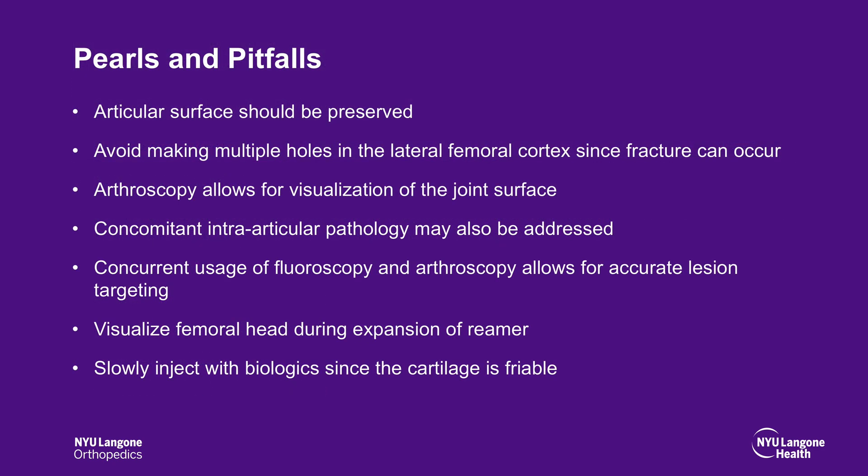There are a few pearls and pitfalls for this procedure. Care should be taken to preserve the articular surface. A combination of fluoroscopy, arthroscopy, and a guide can be used to determine the optimal entry site on the lateral femoral cortex. Multiple passes with the drill should be avoided to reduce the chance of fracture. Arthroscopic-assisted core decompression allows for visualization of the joint surface to avoid joint penetration during the procedure, and it allows for more comprehensive and accurate localization and treatment of the avascular bone lesions. Concomitant debridement and management of any intra-articular pathology may also be addressed in the same setting. Concurrent use of fluoroscopy and arthroscopy allows for accurate targeting of the lesion. The femoral head should be visualized during expansion of the reamer to ensure maintenance of the articular surface. When injecting the biologics, they should be injected slowly since the cartilage is extremely friable.